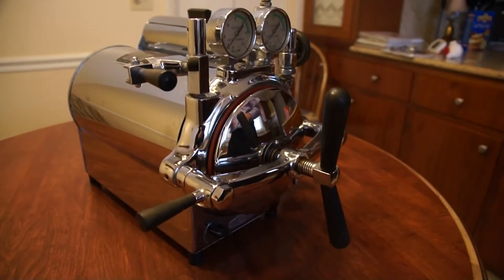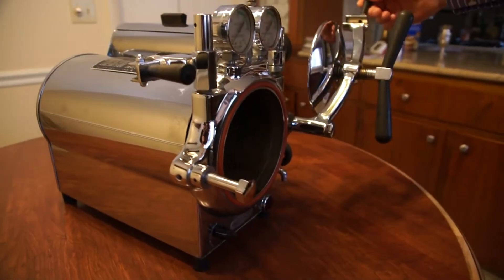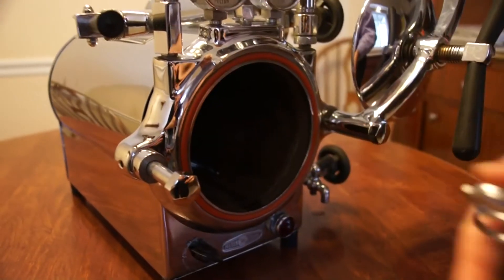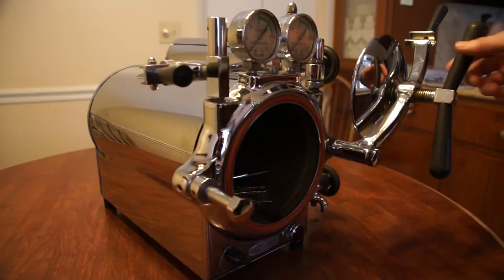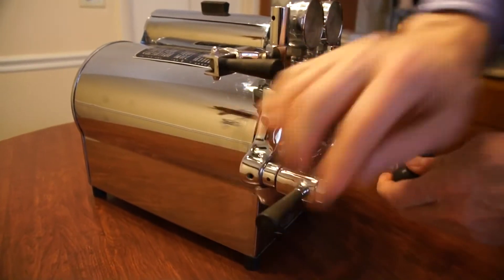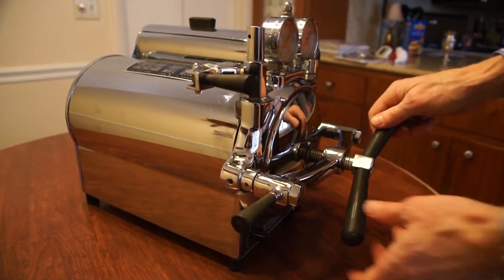Now we're going to load the sterilizer. We will open the door and we will put our instruments inside loosely — just a few for demonstration purposes. We will close it up and snugly tight.